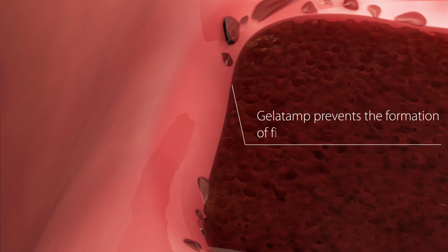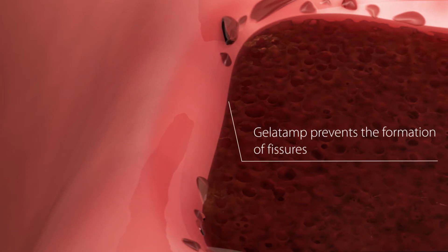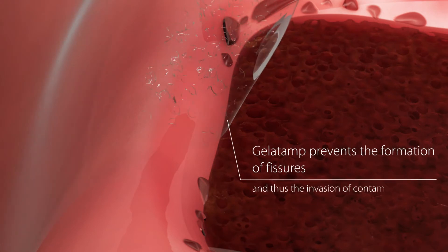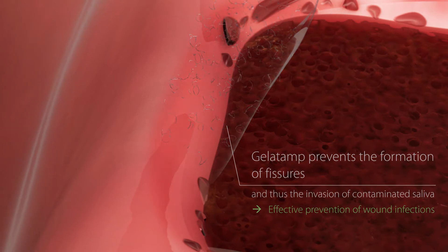Gelatamp stabilises the coagulum in the alveolus and prevents the formation of fissures, which without Gelatamp could develop as a result of contraction of the blood coagulum. This absence of fissures means that contaminated saliva cannot enter the wound, thus effectively preventing wound infections.